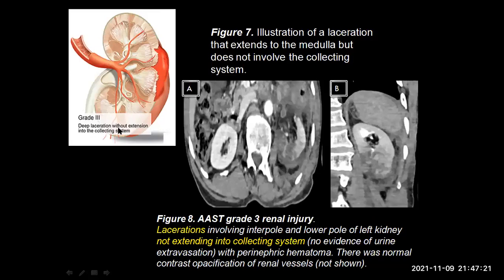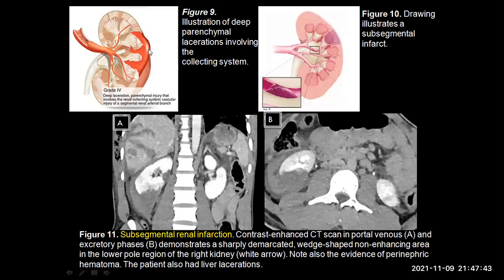Grade 3 injuries include deeper lacerations, that is more than 1 cm, which do not involve the collecting system. You can see that there are multiple lacerations in the inter and lower pole region of the left kidney and none of these extended into the collecting system; hence, this patient was graded to have a grade 3 AAST renal injury. Coming to grade 4 injuries, these include much deeper lacerations extending into the collecting system with active contrast extravasation. Any subsegmental infarct is also graded as a grade 4 injury. You can see that in this patient, in the right kidney lower pole region, there are wedge-shaped non-enhancing areas in keeping with a subsegmental renal infarct — this was a grade 4 injury.